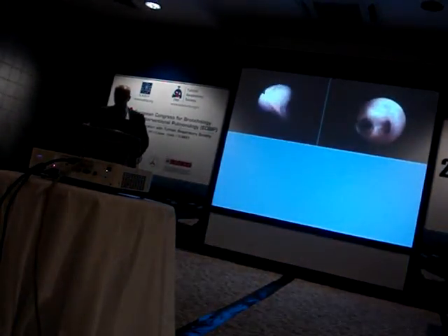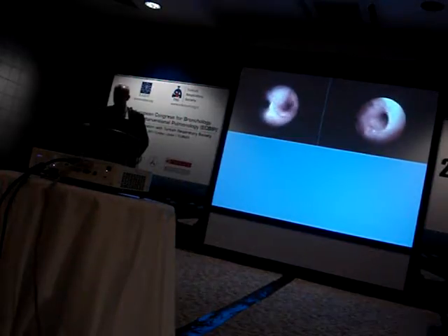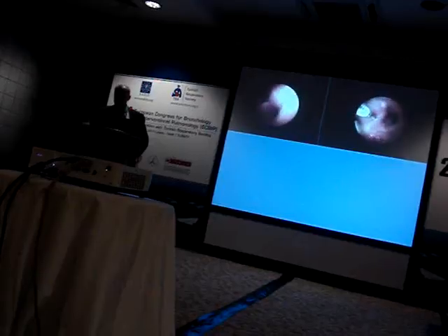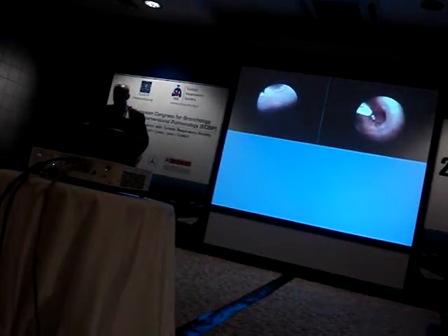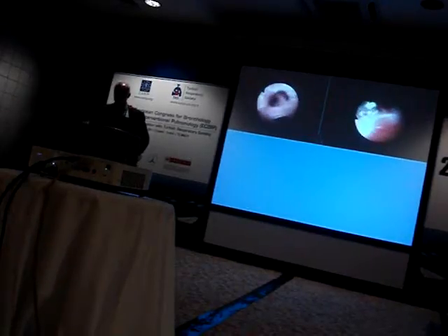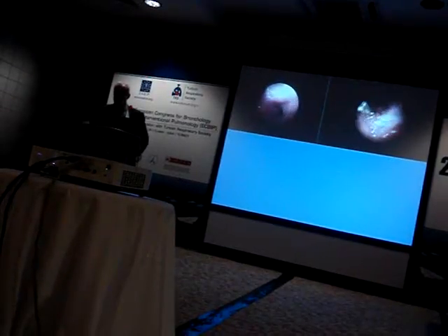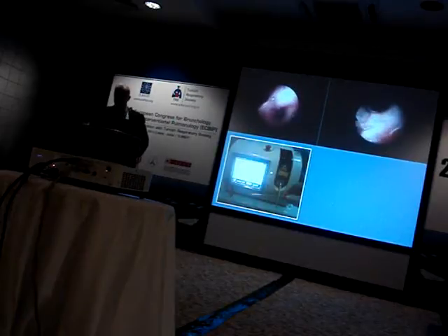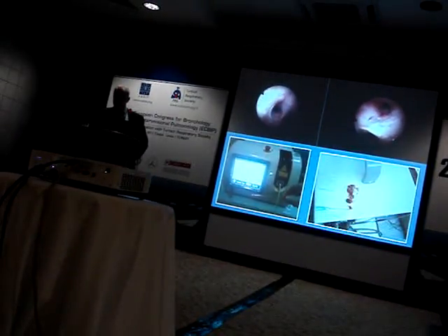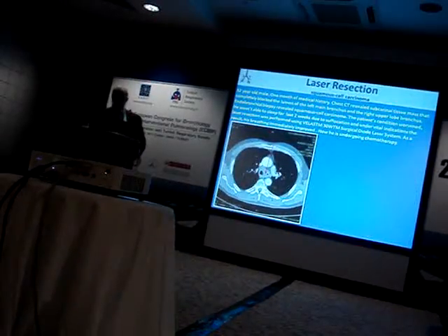One month and one year after laser resection. After one year, we performed a biopsy from a suspicious place. Cytologically, no significant changes, and we were waiting for the result. We are waiting for the results of molecular examination. We used a surgical diode laser system. This is a removed tumor.